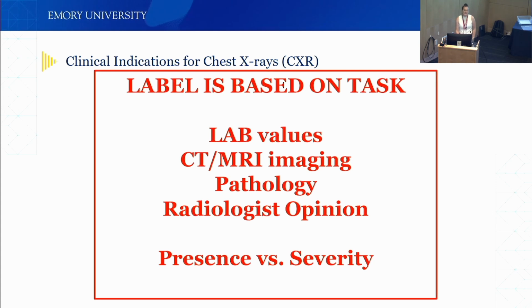So the labels you train these algorithms on depend on the task. You can use lab values, CT or MRI imaging, pathology, radiologist opinion.